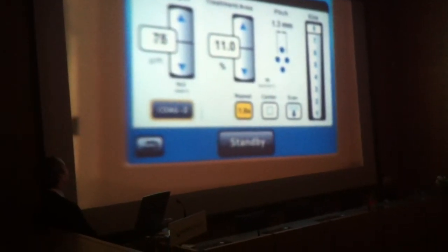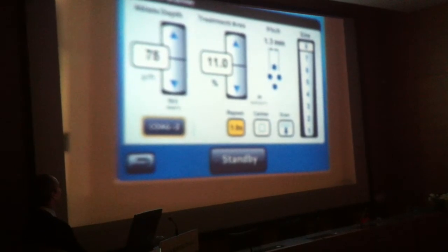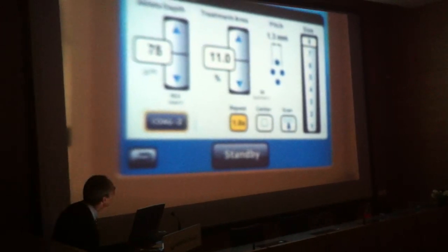Anyway, this is a feature that you don't often see in erbium YAG lasers, and it's more conceived to be typical of CO2 lasers, and this is very important. It's impossible to get focus so near.